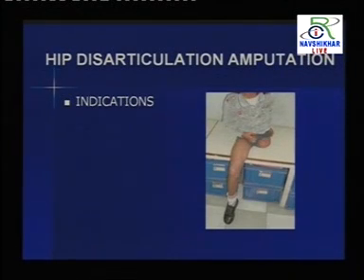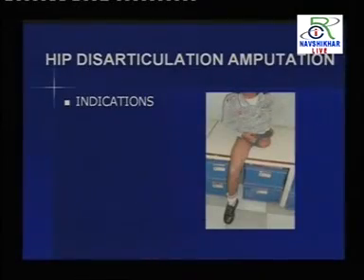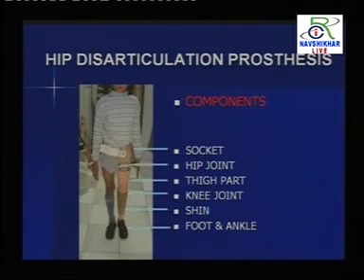In this case, she has lost the hip joint, the knee joint, and the ankle as well. The whole leg has been lost. All three things have to be controlled with the residual part of the body. जो उनका बचा हुआ हिस्सा है बॉडी का, उसके साथ ही उनको she has to learn how to mobilize. So we have a prosthesis for her, and she was fitted with it.